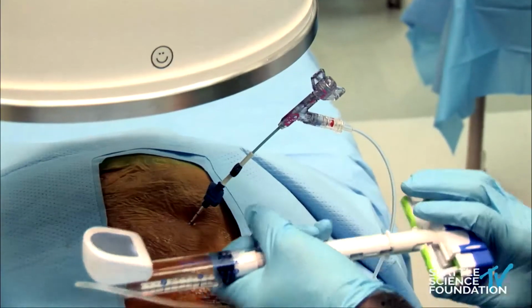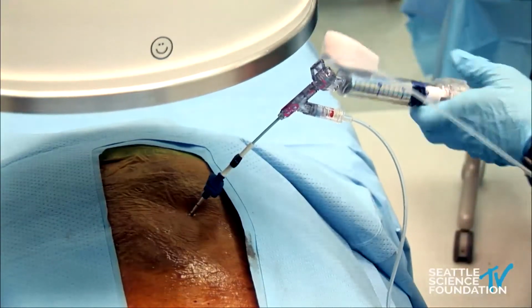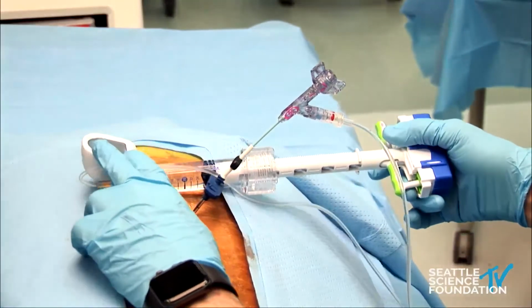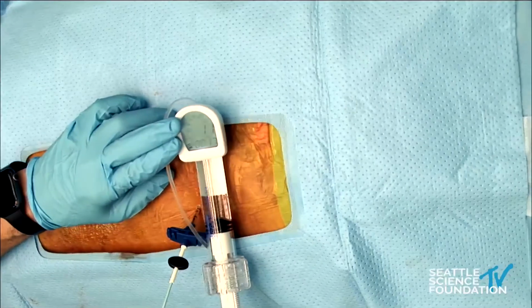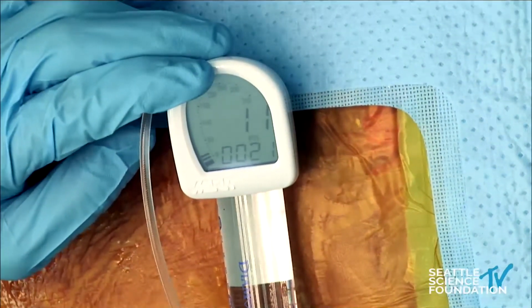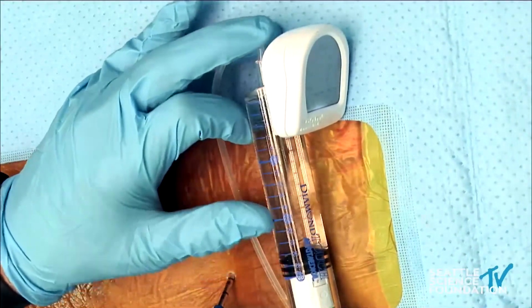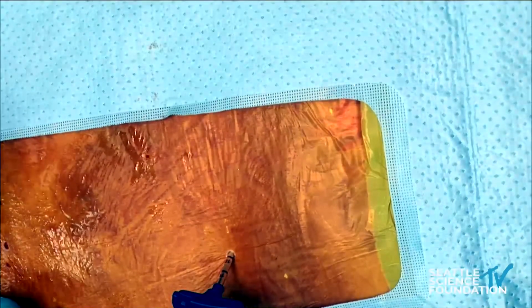So we'll go up, and as we do this and inflate the balloon, we'll go back lateral. And this indicator has a timer. It has a PSI, not only numerical PSI, but it also has the scale over here. So this is a very nice indicator, and it has the amount of contrast, keeping in mind that this will be an 8 cc total volume balloon. So we'll watch this thing as it comes up.